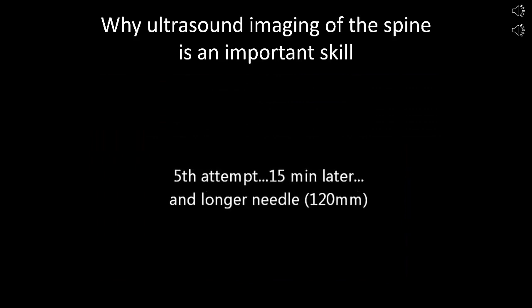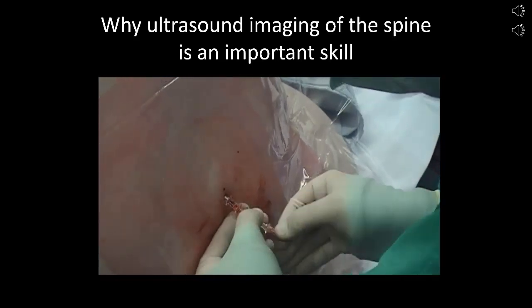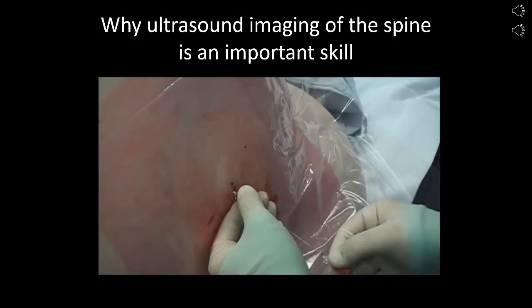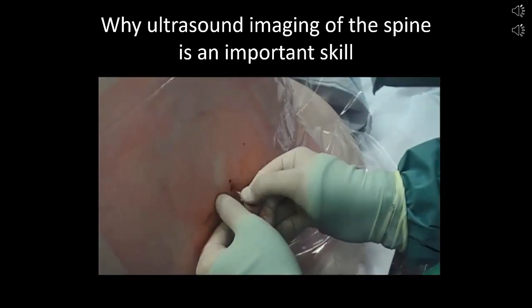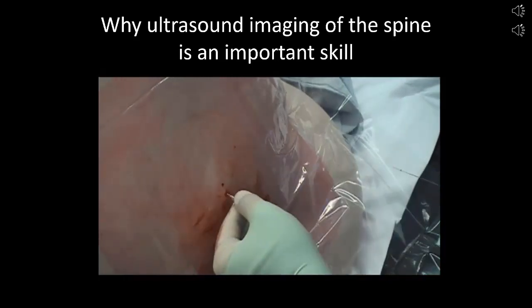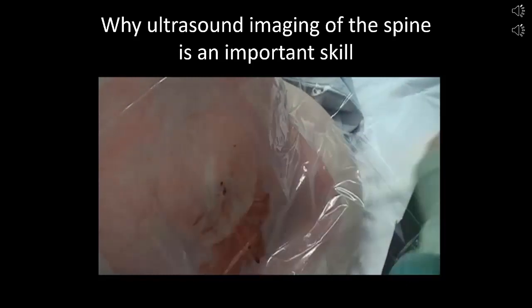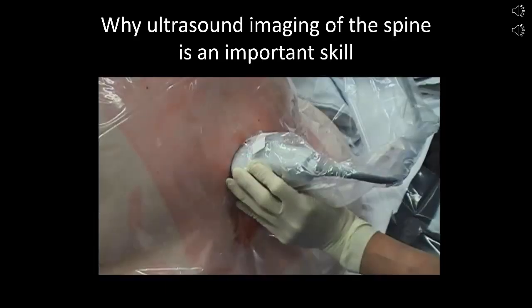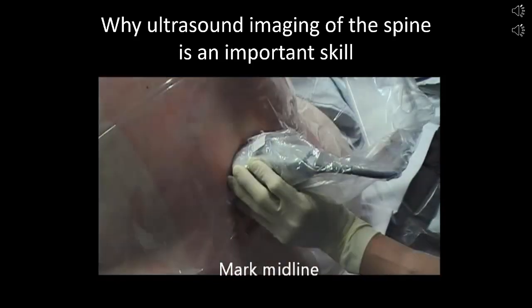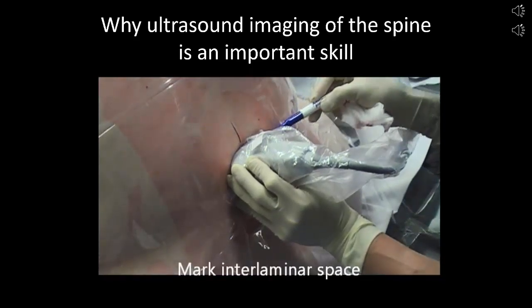Note the suboptimal needle handling and lack of a systematic problem-solving approach to reinsertions. Following the 5th unsuccessful attempt, as per study protocol, ultrasound-assisted rescue was performed. The midline was identified and marked. The interlaminar space was also identified and marked.